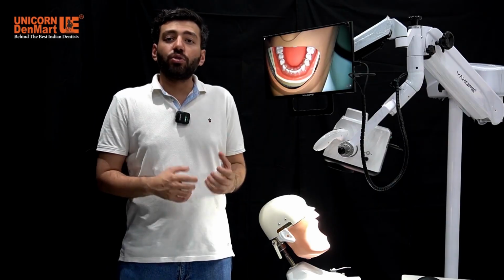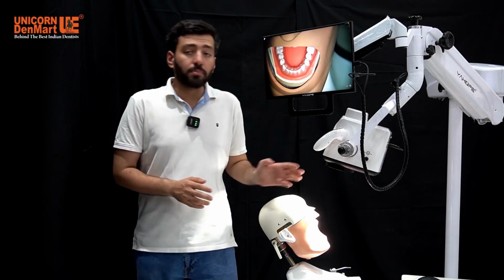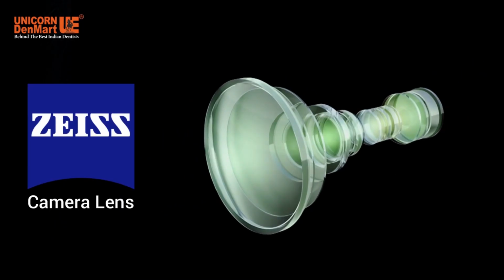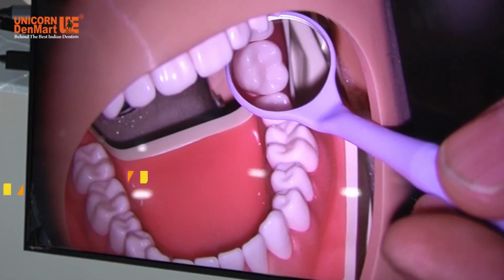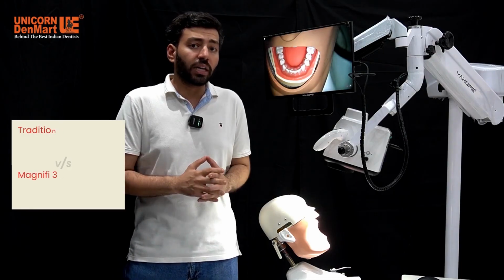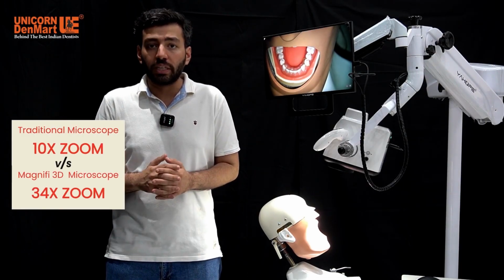Until now we have seen and used traditional microscopes. This is more advanced than all of them. This microscope is completely digitalized. It has a Zeiss camera lens setup. If we talk about it, the zoom and magnification you're getting in this is 34x. Otherwise, in traditional microscopes, the magnification you get stays around 10 to 15x.